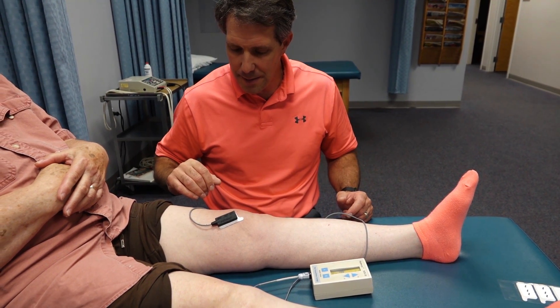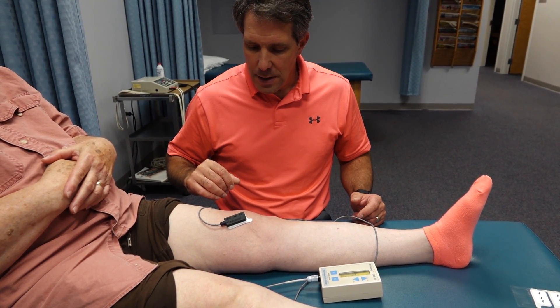So I want you to go ahead and try tightening again. Great.